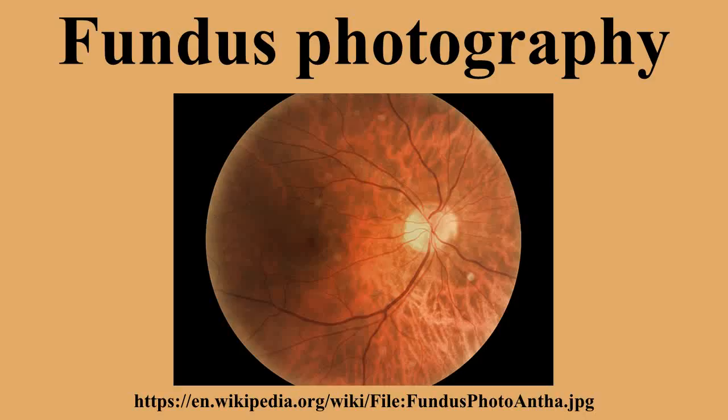Although the news was encouraging and showed promise, the vision of capturing a satisfactory photo of a human ocular fundus was still far from reach. Early fundus photos were limited by insufficient light, long exposures, eye movement, and prominent corneal reflexes that reduced the clarity and detail. It would be several decades before these problems could be rectified.